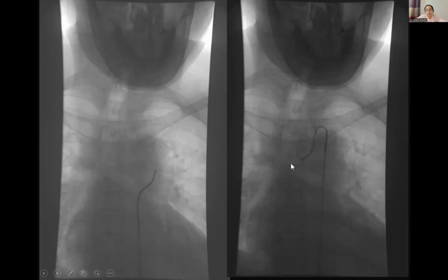And also we have to know that these reverse curve catheters are called reverse for a reason. When the origin of the vessel is hooked, if you push the catheter forward, the tip is going to move backwards. However, if you pull it backwards, the tip is going to move inwards. That's why they move in a reverse direction. When you introduce them, you cannot introduce them like this. They are stretched out, their curve is opened, and they're introduced over a wire. Then the formation of this curve has to take place inside the body.